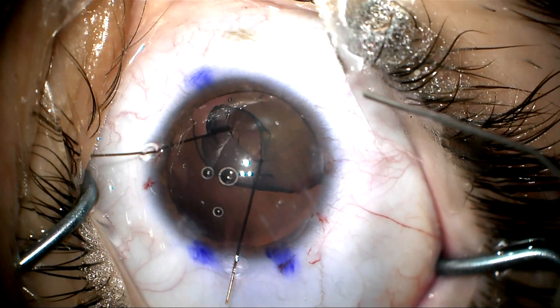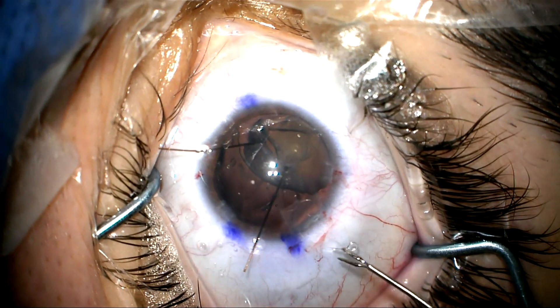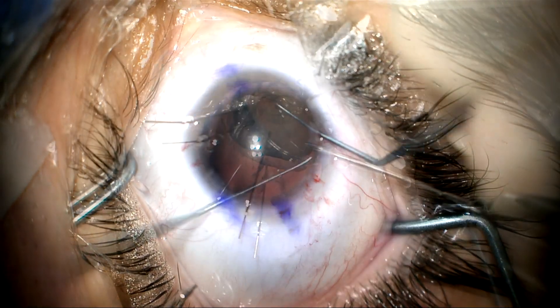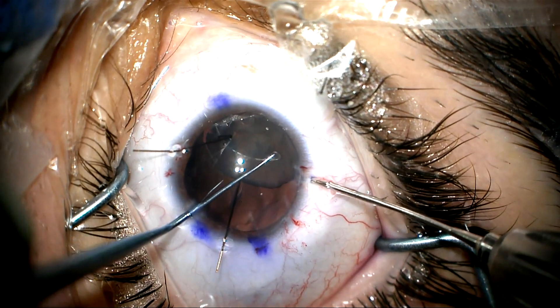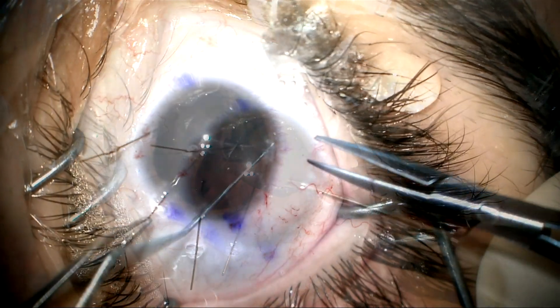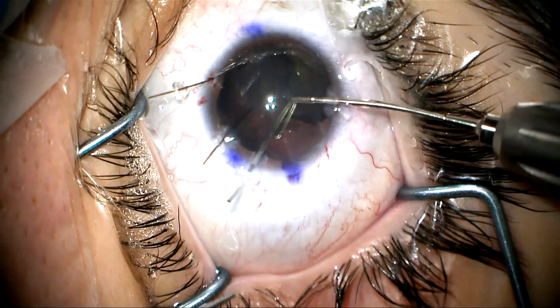Now we're going to go ahead and inject dispersive viscoelastic in the capsule bag to expand it. I'm going to use a capsule tension segment and place this in the capsule bag. What I want to do is hook this to bring it over and center the lens a little bit better and stabilize it so I can go ahead and remove the lens, because we want to try to preserve the capsule bag.